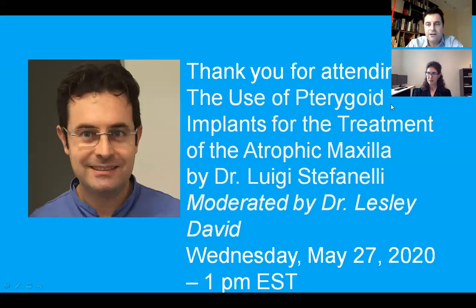So the error reported, I can't remember exactly, but was at least 15 degrees by using the static guide, because he just used the pilot drill and then he proceeded freehand. So for the pterygoid implants, it is very important to use a dynamic navigation system for another reason, because with a static guide, you put the guide and yes, you proceed in a blind surgery.